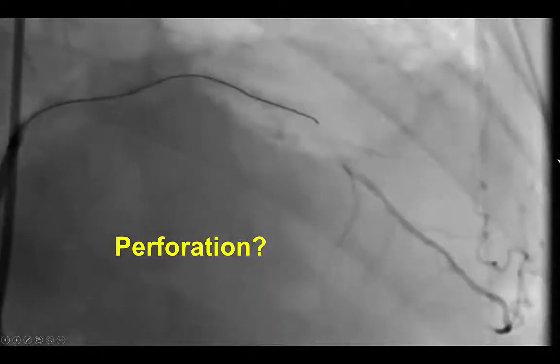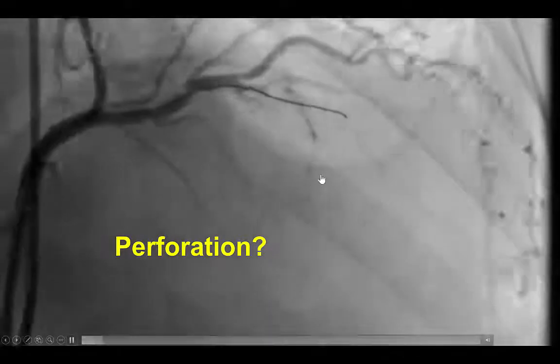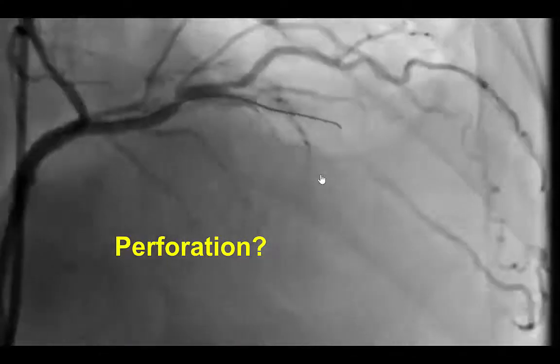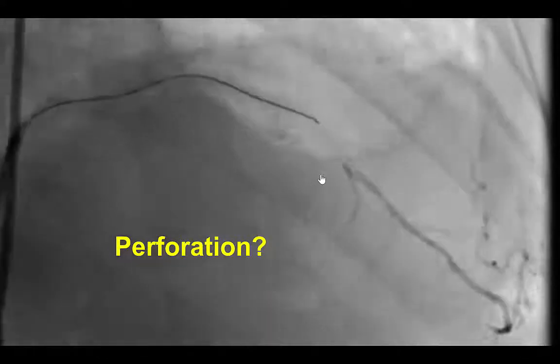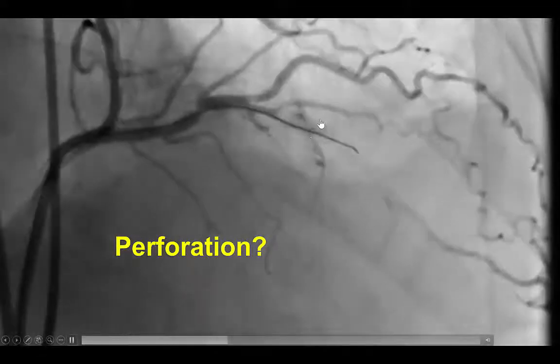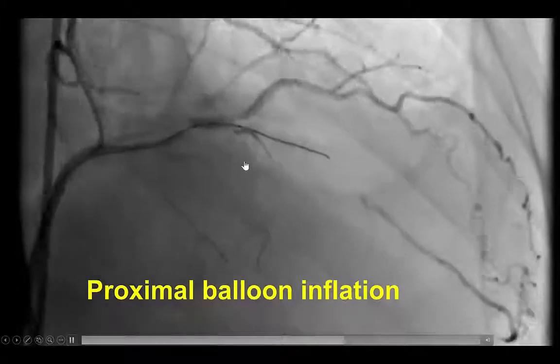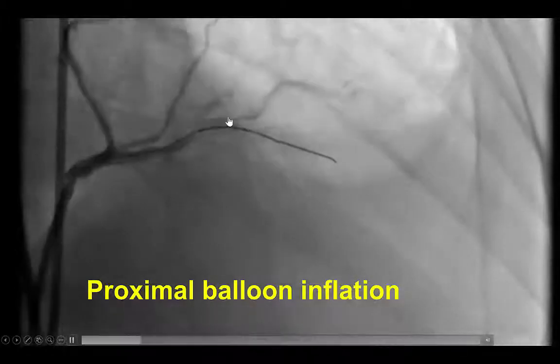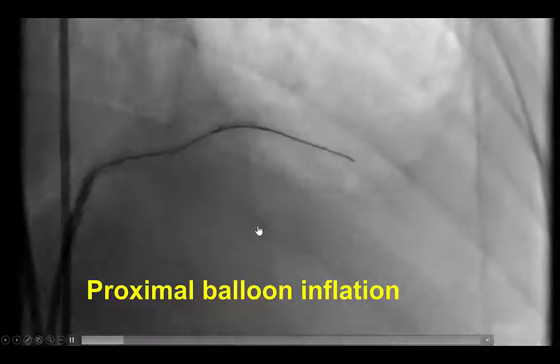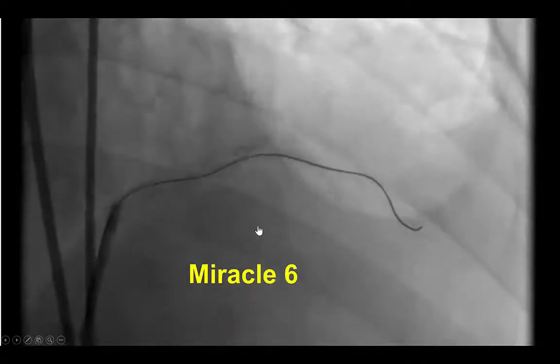During these attempts, there was contrast extravasation at the site of the proximal cap, which was surprising given that we had not used very stiff guide wires, but this can happen if there are bridging collaterals. That was a source of concern, and that is why we inflated the proximal balloon to stop the flow into the segment. There appeared to be hemostasis at that time, with subsequent injection confirming temporary sealing.